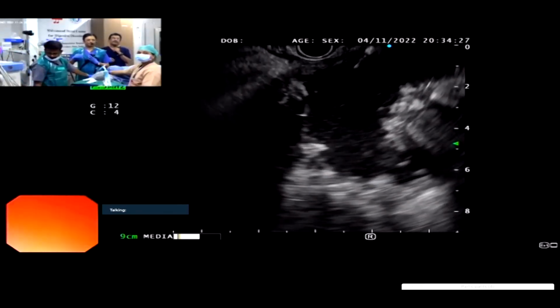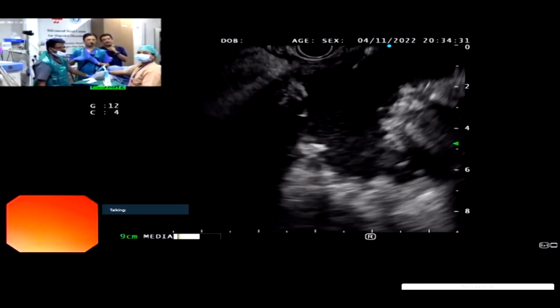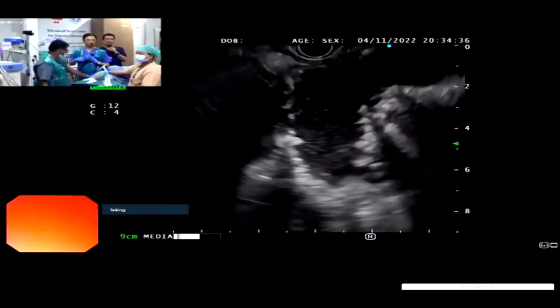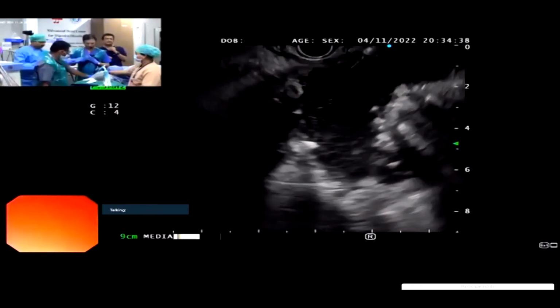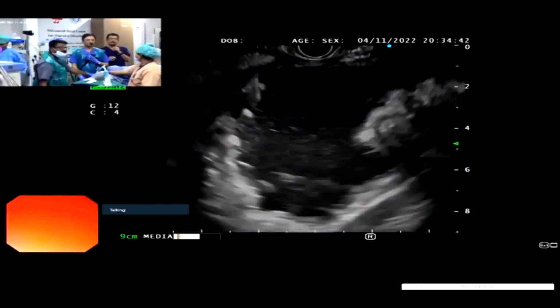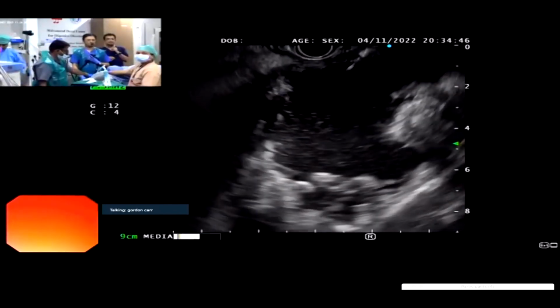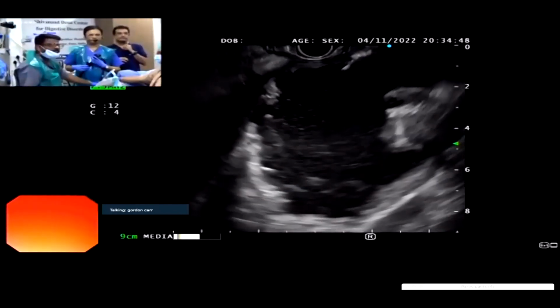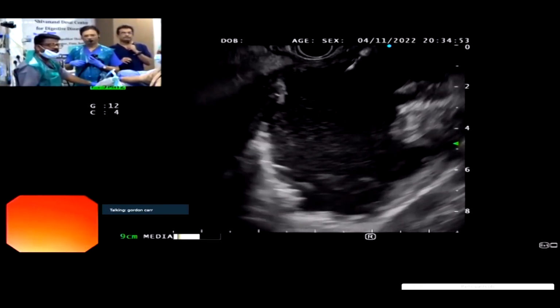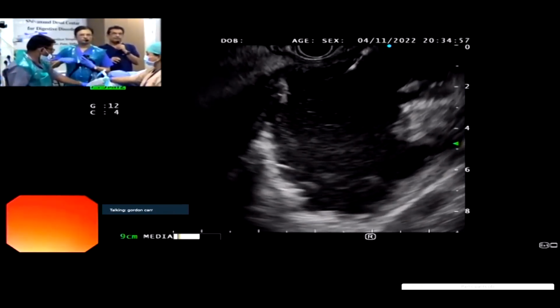You usually will not get a penetration very easily if it is a thick-walled pseudocyst. So we've had a lot of problems. I don't remember the last time we used it. I think we consistently use only the 6 French cystotome for all our procedures. But if you are using 2 guide wires or you are putting 2 stents, then you pass the guide wire. It adds one more step.